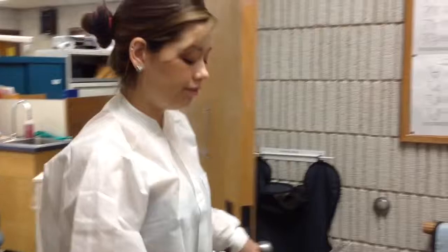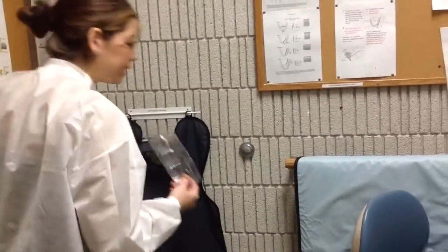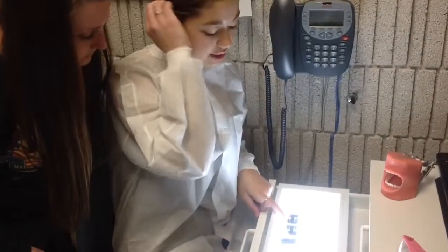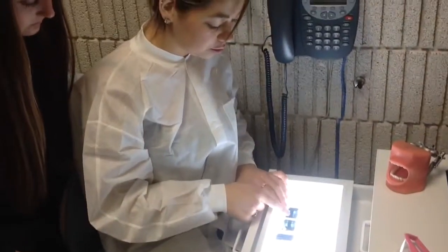Hi, Erin. I have your films. They're right here. I just want to show you a couple things that I think you might find interesting before the doctor comes in. So if you want to stand up, you can come right over. So these are the pictures. These two, we call them bite wings, and these are the ones that show your teeth on the side. So you can see in between your teeth.